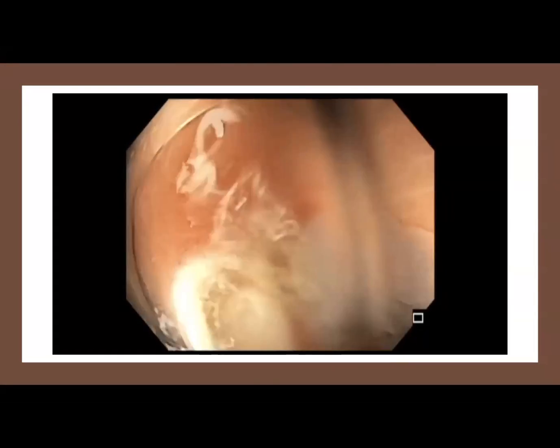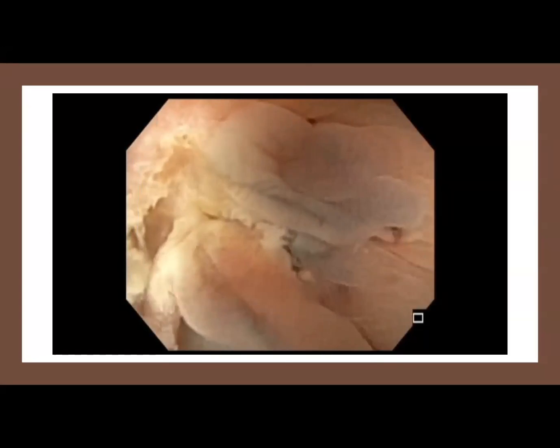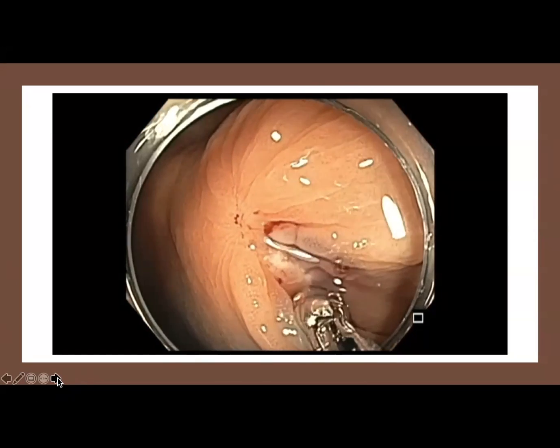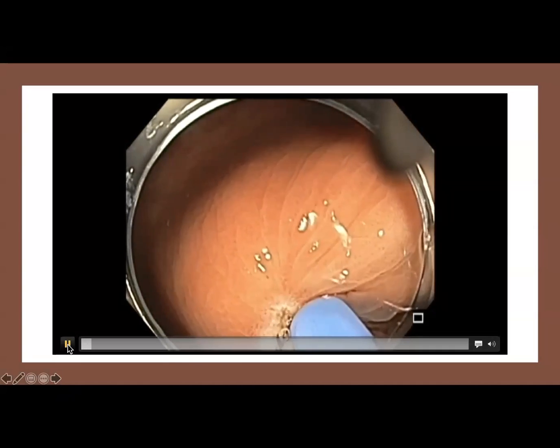So as you can see, the advantage of having a cap is that you can use a little bit of water and then get closer to satisfy yourself that you removed the polyp completely. So then we went ahead and did the APC.